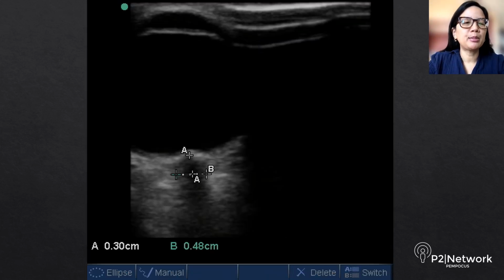So here we're measuring optic nerve sheath diameter 3 millimeters posterior to the retina. Again, we take our first set of calipers, measure 3 millimeters posterior to the retina, and then measure diameter at that 3 millimeter mark. Now here the optic nerve is entering the retina at a slightly oblique angle, and I think that the measurement that you see here on the screen is likely an overestimation, but I don't think it's that far off. This patient's optic nerve sheath diameter, as we measured it, was 4.8 millimeters, and we measured the optic nerve sheath diameter in the other eye as well, and that was also elevated.